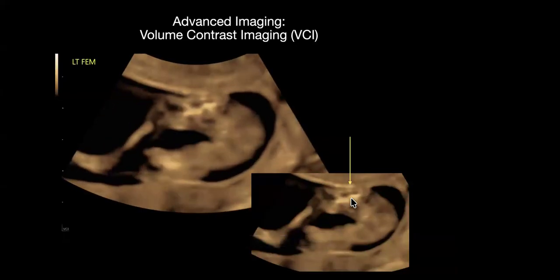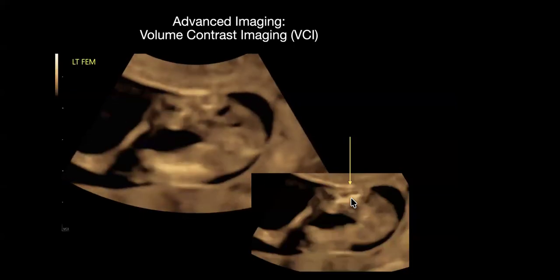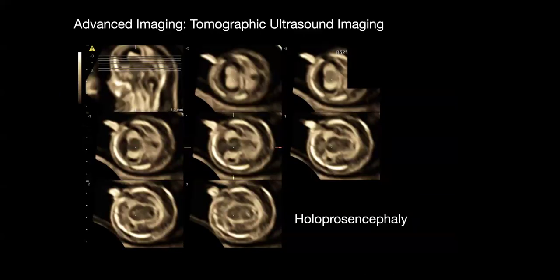And of course, the way baby was positioned was tough for us to see the head. So we did more advanced imaging. And this is where we did multiplanar, and we also did tomographic ultrasound imaging. Tomographic ultrasound imaging almost produces CT-like structures. So once you get that volume, it'll give you these slices throughout the head.